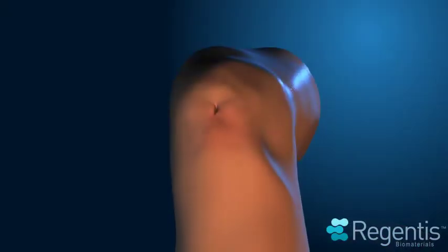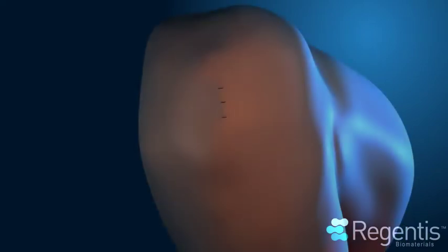To complete the procedure, the joint is cycled several times. The Gelrin-C implant is visually inspected to verify that it remains in place.